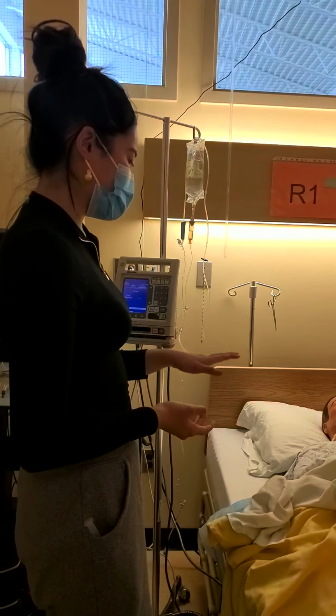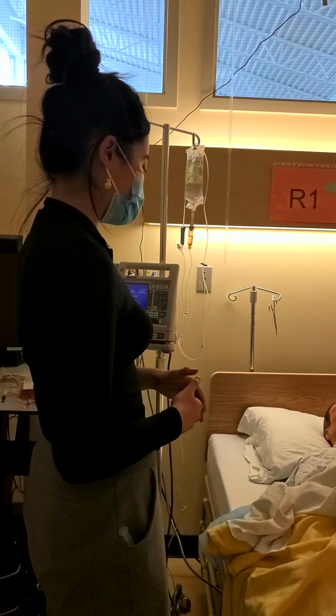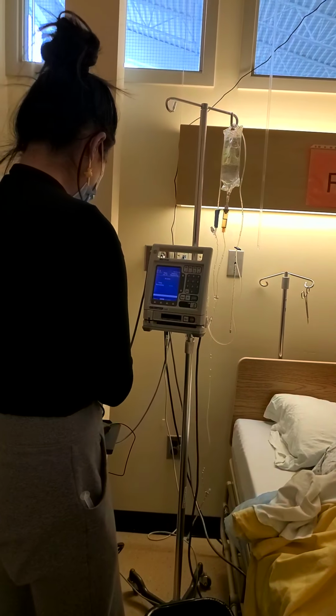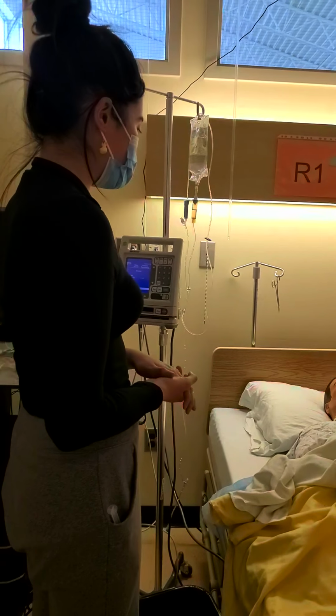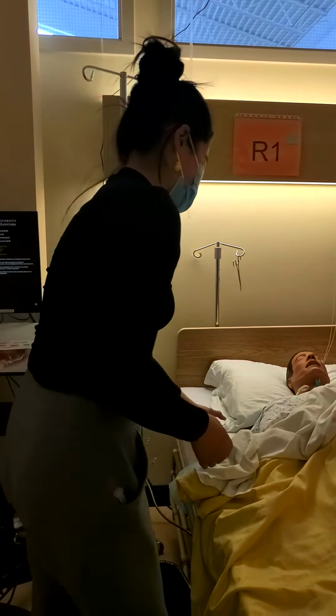So I've taken your baseline vital signs, but throughout the transfusion, I'm going to be continuing to take your vital signs. So 15 minutes I'll stay with you, and after that 15 minutes I'll take your vital signs. During the transfusion, every hour I'll take your vital signs, and at the end, and then 1 hour after your transfusion. And I know you signed the consent, but is it okay if we still do this? Perfect. Okay. So I've noted that the emergency line is here, and it's primed with normal saline, so that looks good.